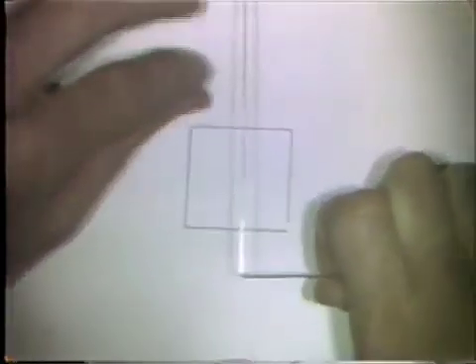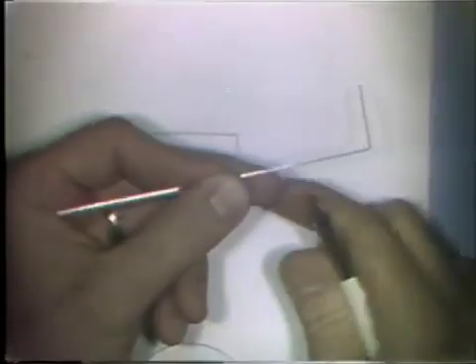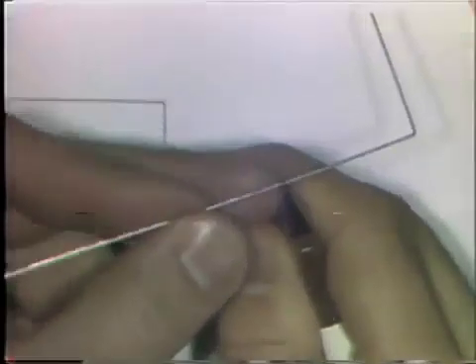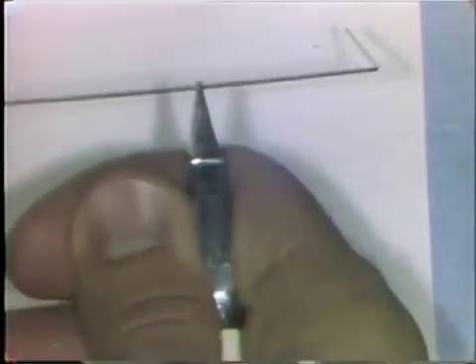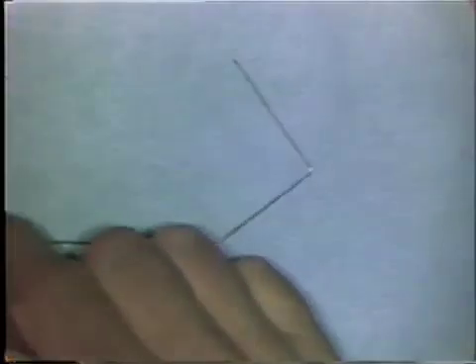You place the wire in the beaks of the plier so that the right angle bend that you've already made is at exactly 90 degrees to the beaks of the plier. It's important to orient the wire properly in the plier beaks before you make any bend in order to maintain the flatness of the wire. You make about a 30-degree bend in the wire, about one-third of the way, and at this point you check the flatness of the wire. Make sure you have it in the same plane of space as the first arm.